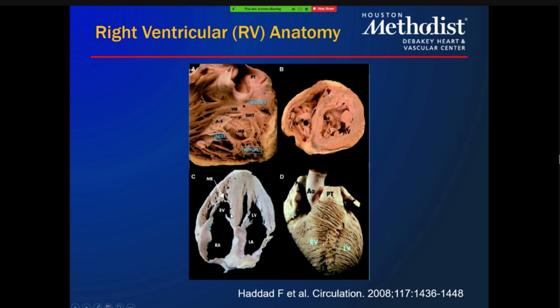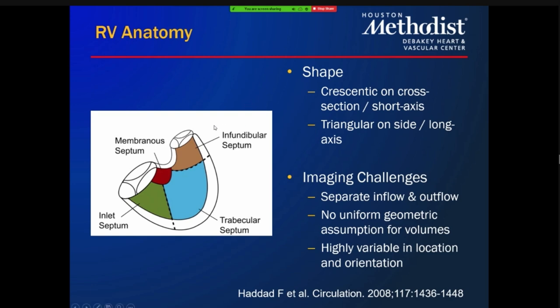It is contiguous with the left ventricle and the septum, the free wall. If you look at enough of this anatomy, especially when we do our measurements, you'll notice that there's actually a bit of RV-LV separation in terms of the septal layer. So those are things to keep in mind. Okay, this is just rehashing what I described before, the fact that you can roughly separate it into an inlet, trabecular septum, apical region, and then the infundibular region: inflow, outflow, and apical region as well.